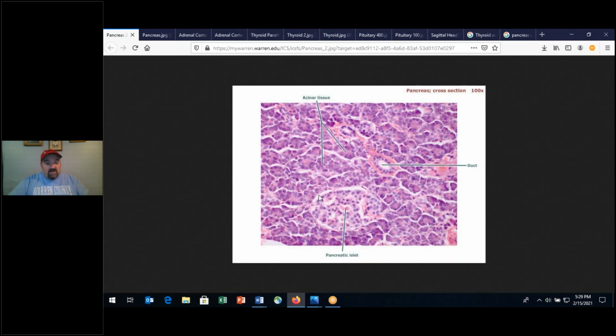All right, so this would be a pancreatic islet, aka an Isle of Langerhans. It looks like a little island amidst this exocrine digestive function tissue, exocrine tissue, endocrine tissue. Okay? So quite interesting, right? How many of these tissues have combinations of different types of tissues, right?